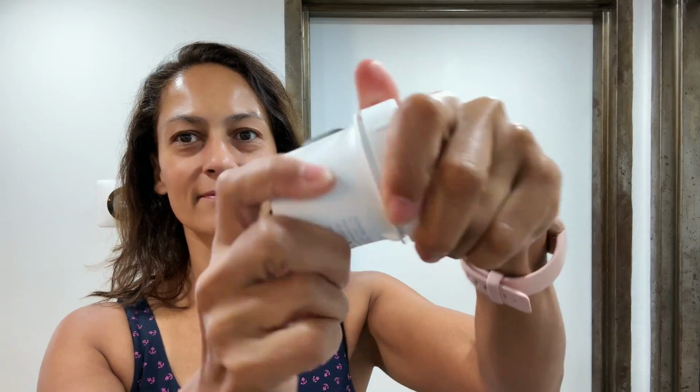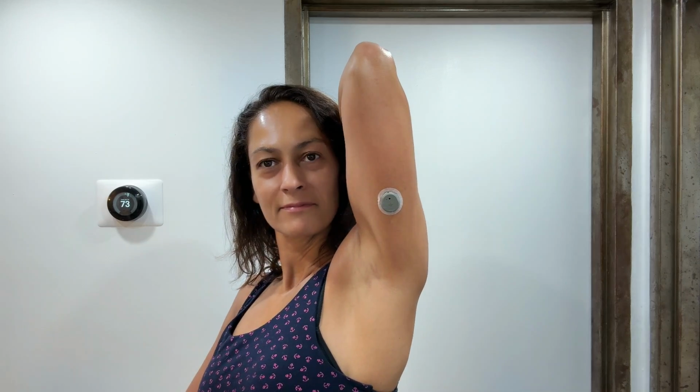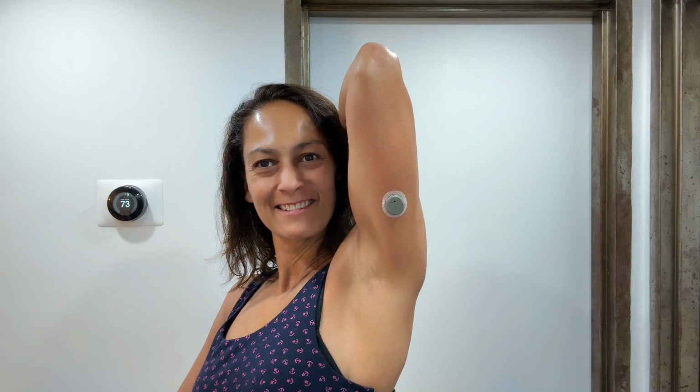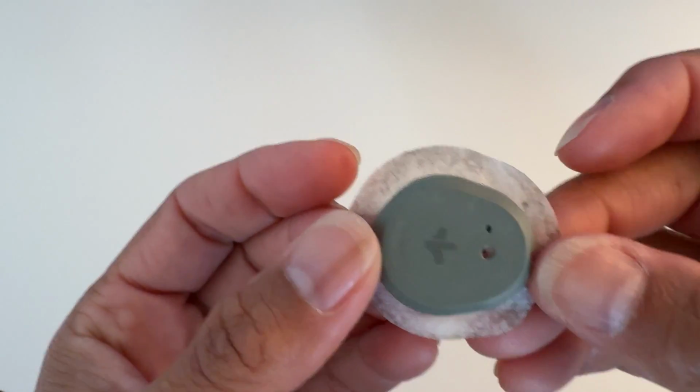You insert it by unscrewing the cap, lightly pressing the inserter against the back of the arm, and a needle will quickly insert the sensor underneath the skin. The needle does not stay in your arm, but retracts back into the inserter and only leaves behind a small, thin sensor. Here you can see the sensor up close.